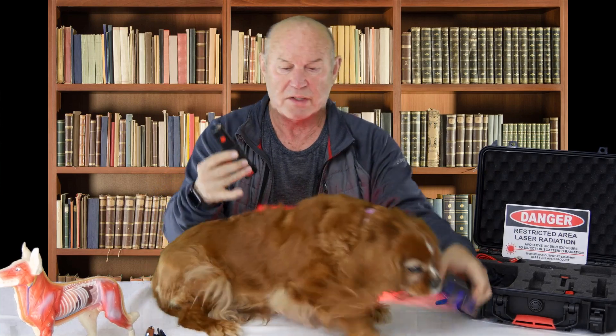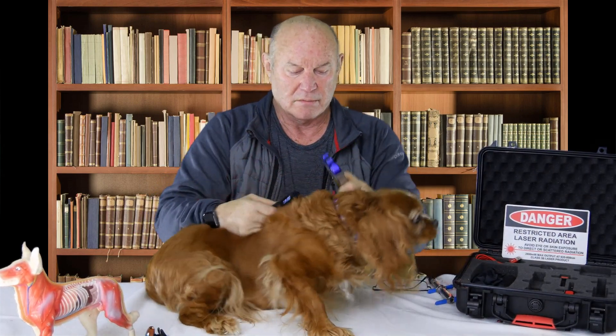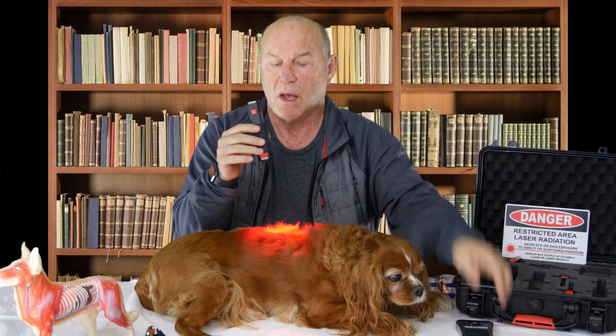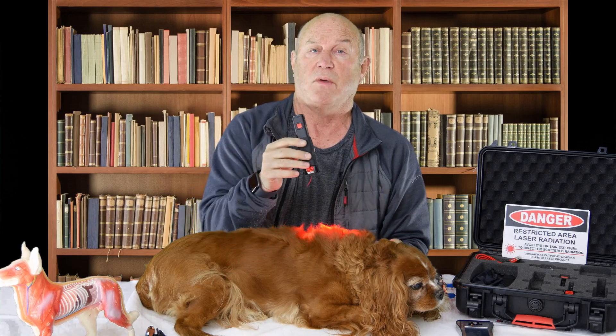Now, if we were going to use a different device, we'd put in 4 lasers for 3 minutes each, turning it off between each one — lasering another 3 minutes each time. But with this device, we're able to deliver all 16 frequencies at one time. The reason this instrument seems to work so much better is that we're able to deliver all of them in a single sweep, and it spends about 2 to 4 seconds on each frequency, cycling through them over and over. So this is the therapy, and this is all we have to do.